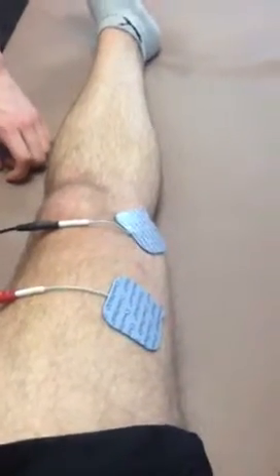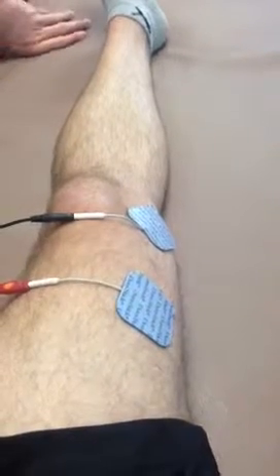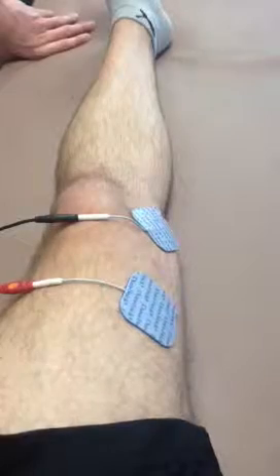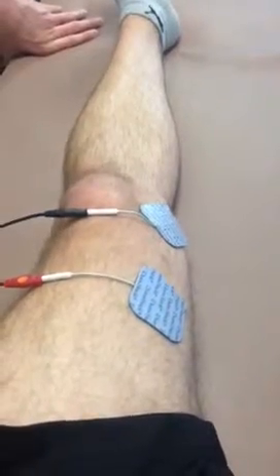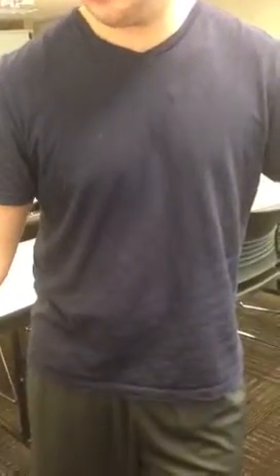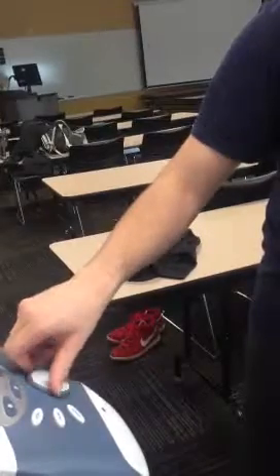Alright, so now I would turn the intensity up, and I just ask the patient during this time if they feel anything, when they start to feel something. It should just feel like a tingling sensation. Do you feel that? Not yet. Not yet. I'll be able to feel until I get up to like 10. There, now I can. Okay.